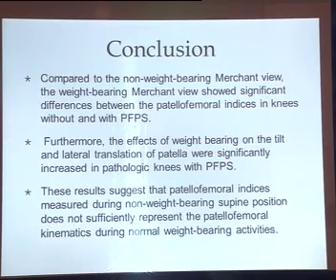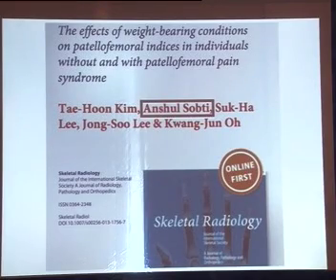Thus, to conclude, compared to the non-weight-bearing Merchant view, the weight-bearing Merchant view showed a statistically significant difference in the patellofemoral indices in knees with and without patellofemoral pain syndrome. Furthermore, the effects of weight-bearing on the tilt and lateral translation of the patella were significantly increased in the pathological knees with patellofemoral pain syndrome. These results suggest that the patellofemoral indices measured during the non-weight-bearing supine position do not sufficiently represent the patellofemoral kinematics during normal weight-bearing activities. Thus, there is a need for a shift from a standard to a standing Merchant's view. The study has recently been accepted for publication in the International Journal of Skeletal Radiology.